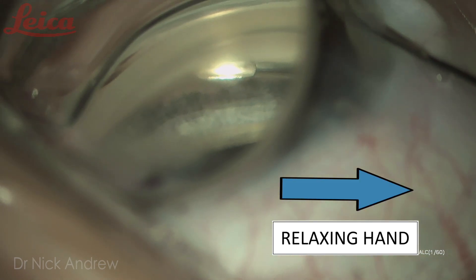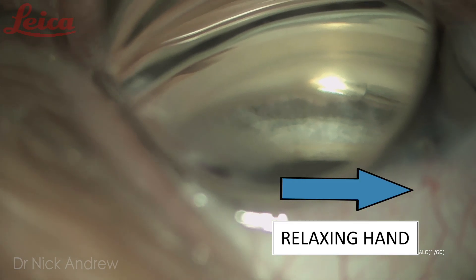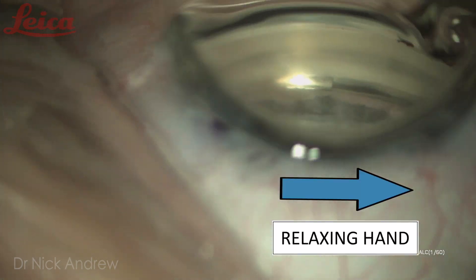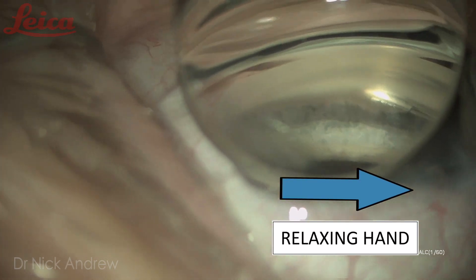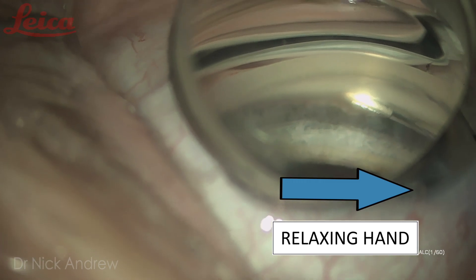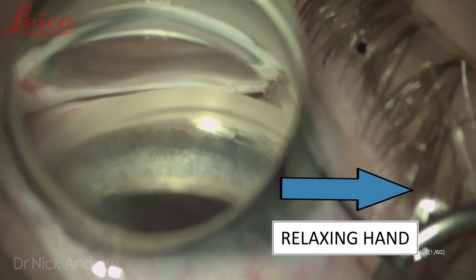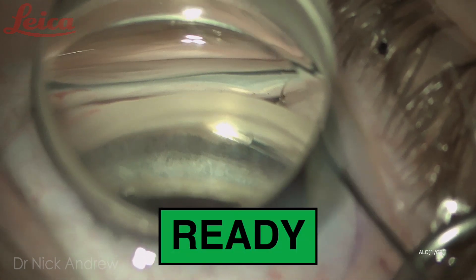Pushing forwards — and now relaxing the hand. You'll see the eye retract right back around towards the neutral position. Pushing forwards a little more to get better seating, then relaxing the hand — the eye comes right back around. Now I'm making sure there's no outward pressure: hand completely relaxed, no outward pressure on Schlemm's canal, no deformation of the limbus. Now I'm ready to implant.